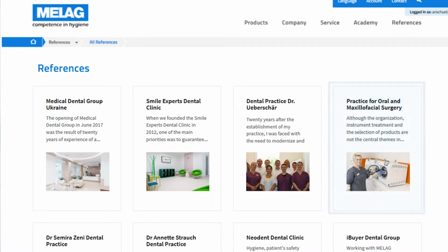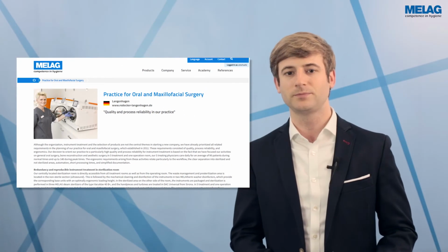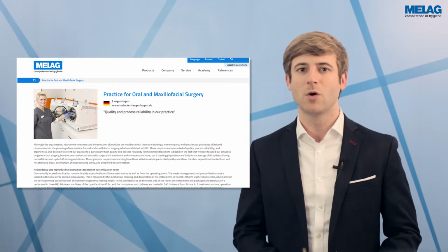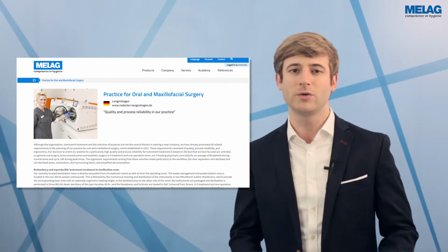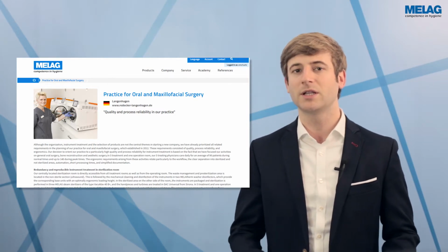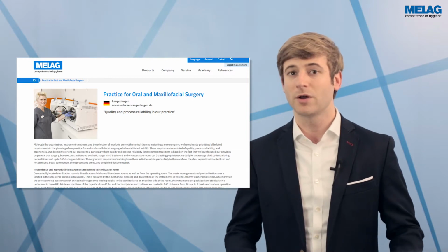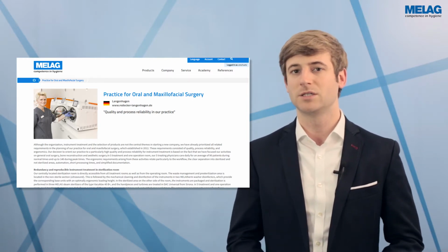And then you will be shown a complete report of one of our reference clinics that includes experiences, insights on our products, and also images of how the MELAG products can be arranged and how different clinics work with our product workflow. These reference reports will benefit you greatly and will support you in your daily business, because they show your local partners how other clinics all over the world use our products and how they are working with the MELAG system solution.